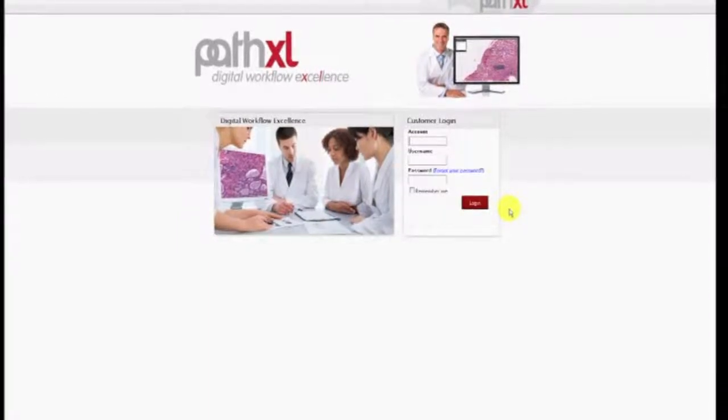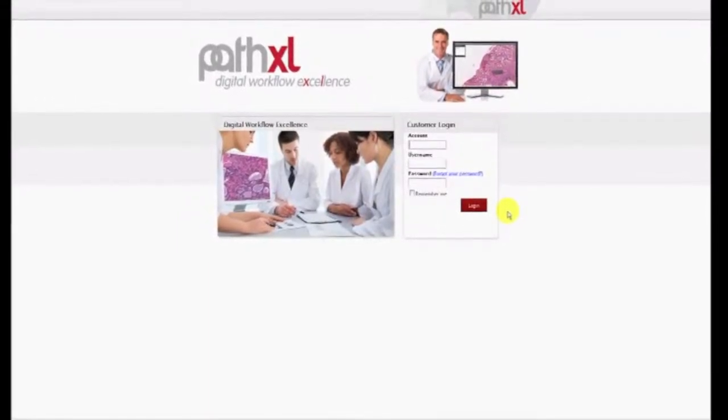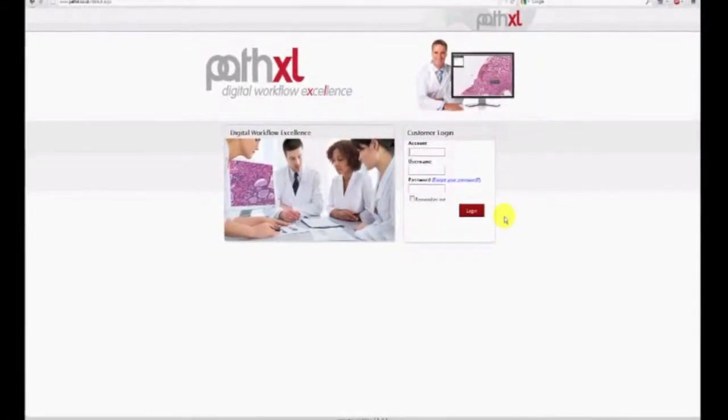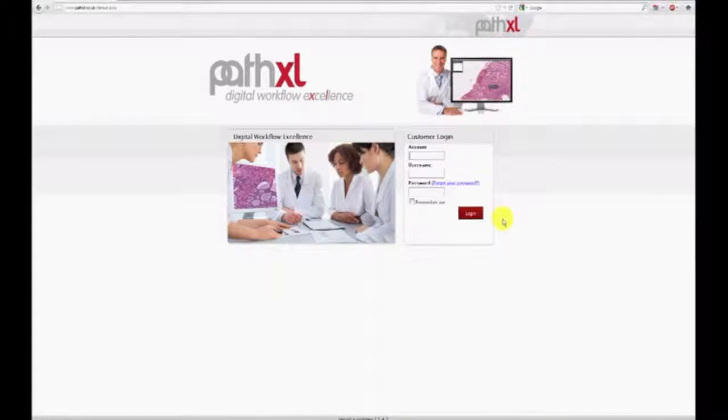Authoring virtual slide and associated content in PathXL Tutor is easy, straightforward, and allows you to create online courses and training media in minutes. Let me show you how.